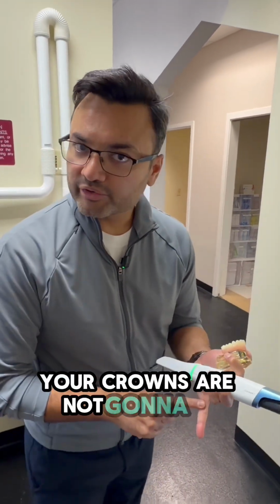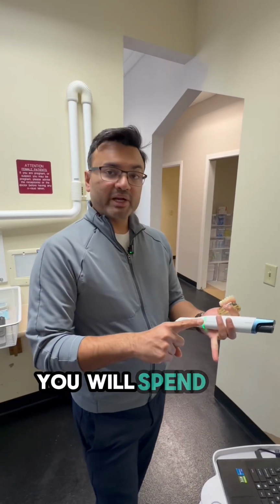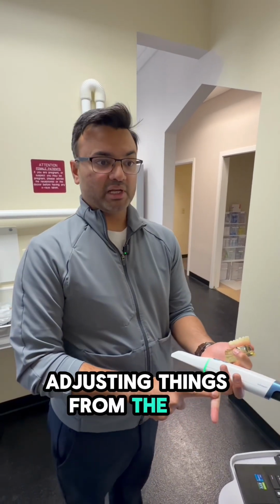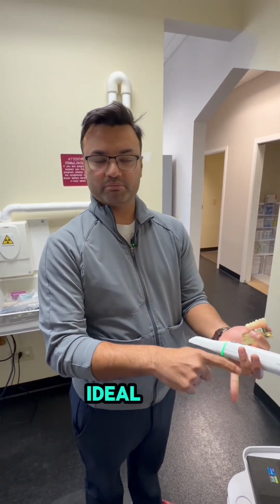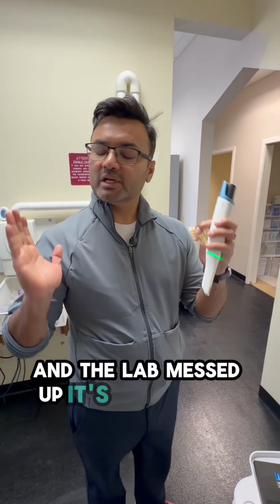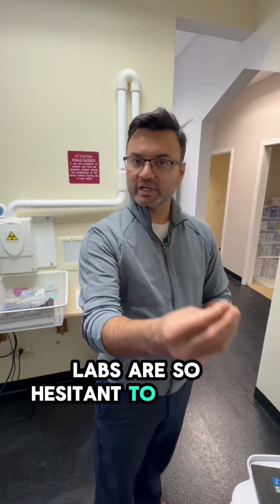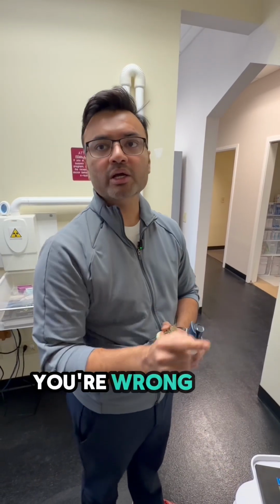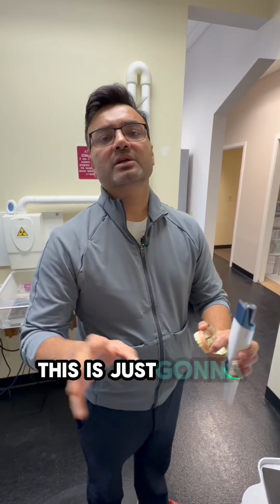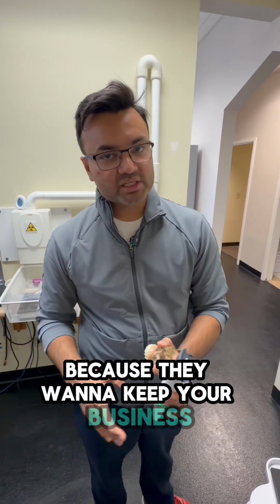Your crowns are not going to fit, your mouth guard is not going to fit, you will order things from the lab, you will spend so much time adjusting things from the lab, and you're going to blame the lab: I had my most perfect ideal prep and the lab messed up. It's really not the lab that messed up. I swear to God, labs are so hesitant to tell the doctors, because they don't want to hurt your ego by telling the doc, you are wrong, you gave me a bad scan. They're just going to work with what you gave them. They're going to be so humble because they want to keep your business.